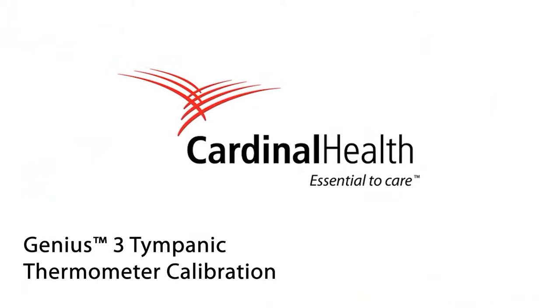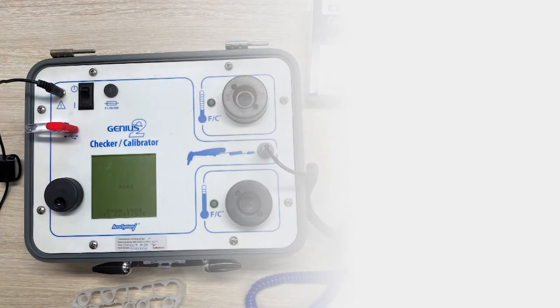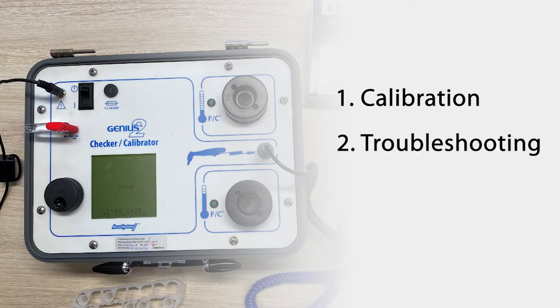Hello everyone and welcome to the Genius 3 tympanic thermometer calibration video. In this video we will cover the following topics: a calibration from start to finish, some errors you might encounter and how to troubleshoot them, as well as resources that we have available.